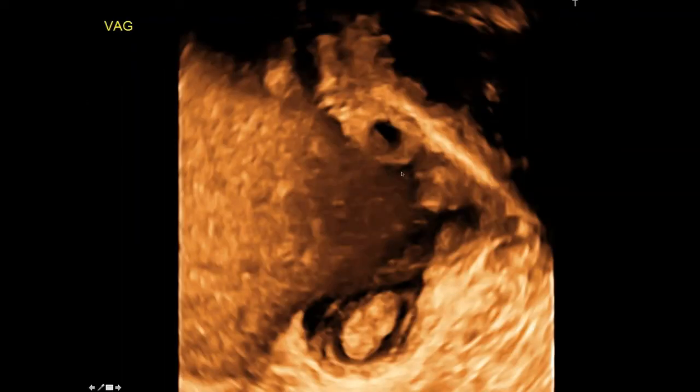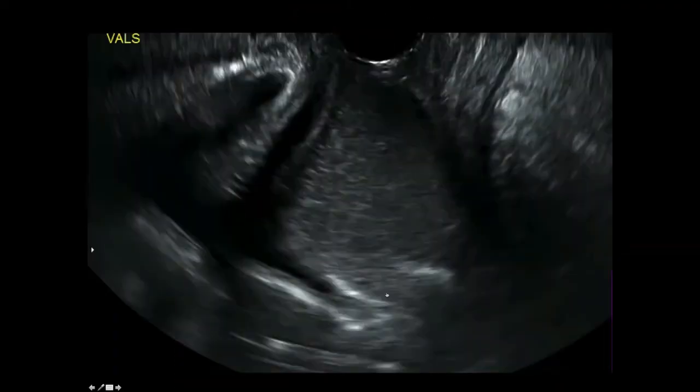Looking at it from the floor of the pelvis, you can see the urethra here. The rectum is pushed over. The vagina is pretty much pushed over and not recognizable. So what is this thing? Well, let's look at it in real time. It's in the vagina.